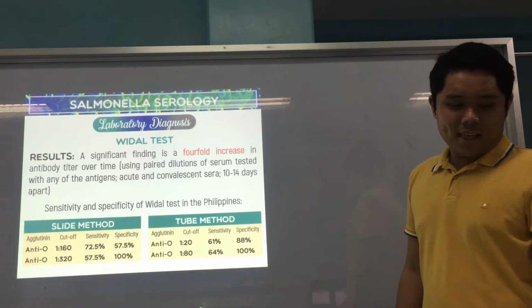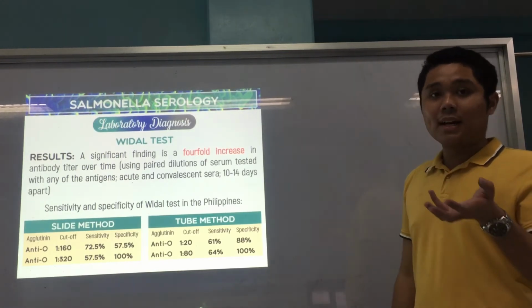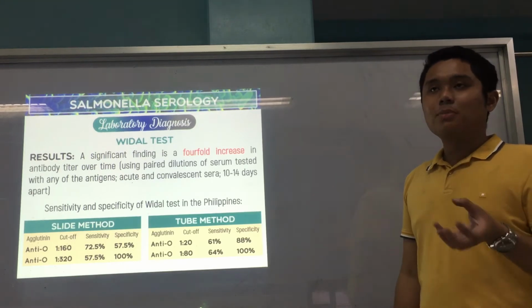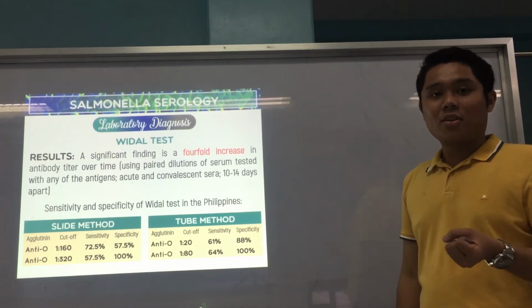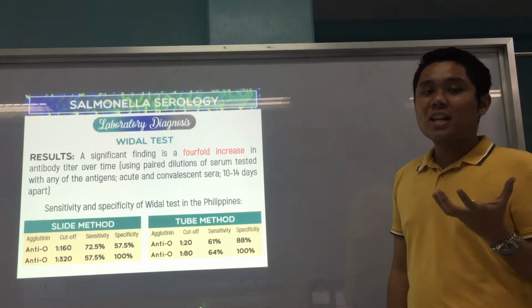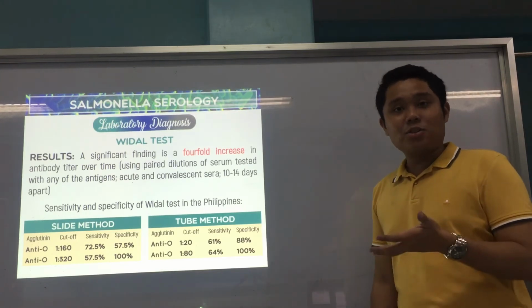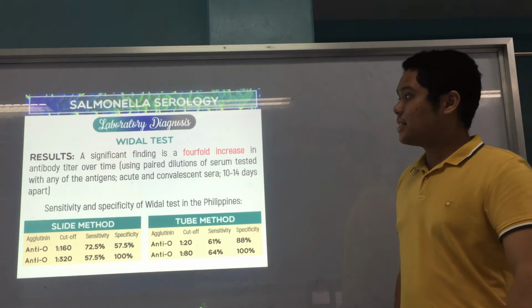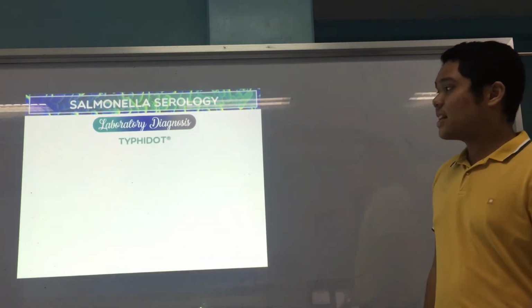Okay, alright, and so that's a Widal test, febrile agglutination test. You're looking for the antigens. You use killed Salmonella O and H antigens. Okay, so you're looking for if the patient has antibodies to the O and H antigen. Okay, alright, that's for Widal test. The next test is your Typhidot test.